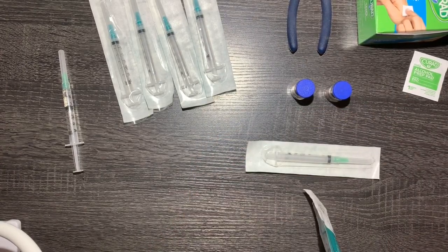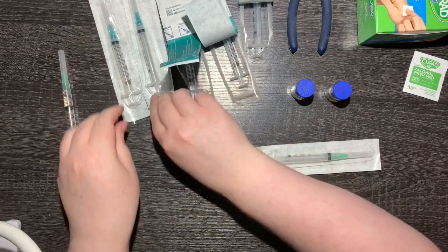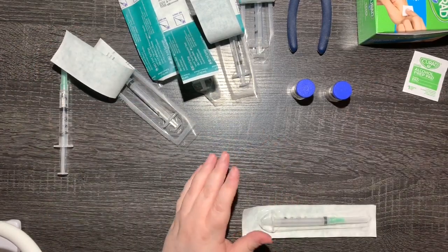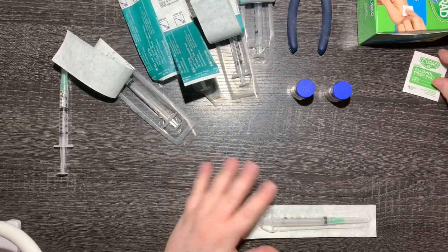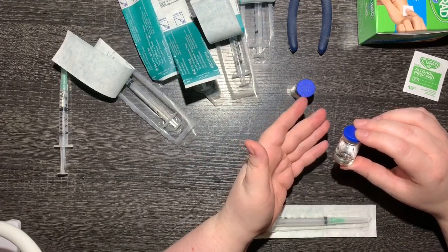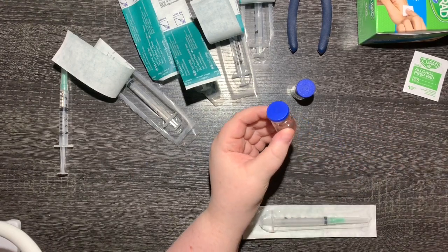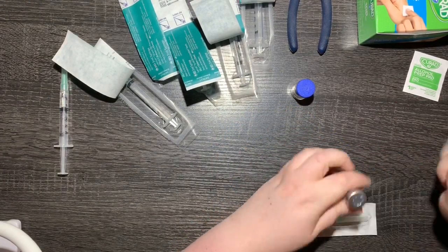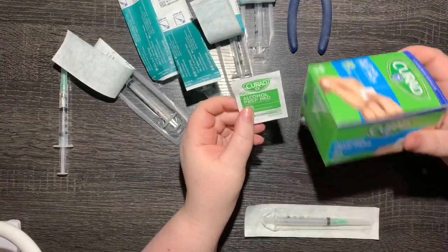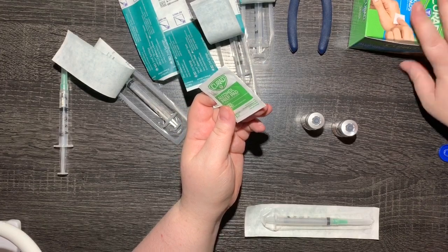I prep the 23 gauge needles by getting them ready to go so I can pull them out quickly. I also clean the tops of the vials before I use them. These vials just came out of the fridge — I keep them in the fridge until I'm going to use them. Once I pre-fill them, I leave them in a completely enclosed drawer so that light can't get to them, because my understanding is this stuff is sensitive to light. I pop the lids and use alcohol prep pads — I got these at Costco, a four pack of a hundred each.